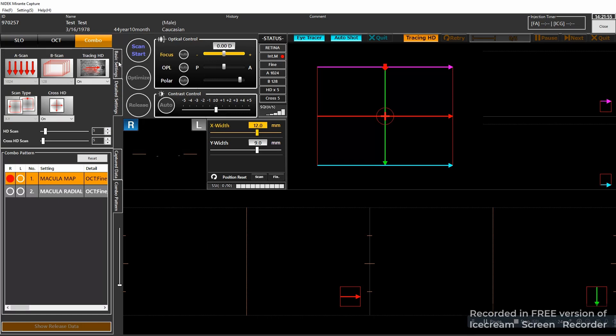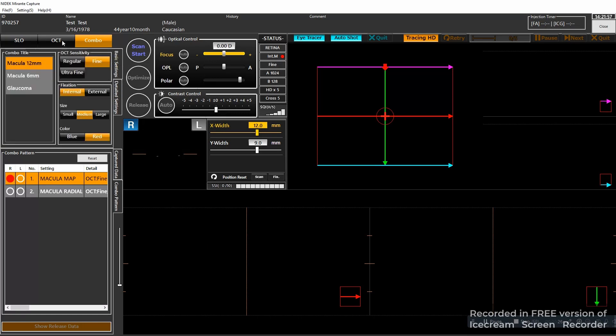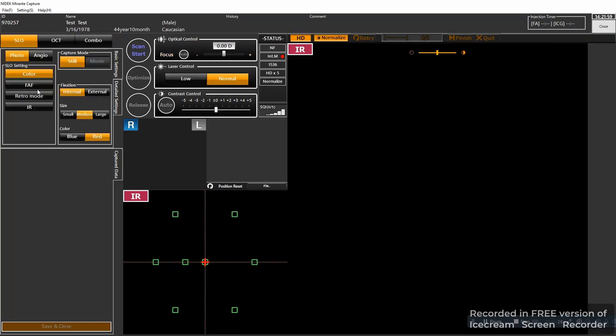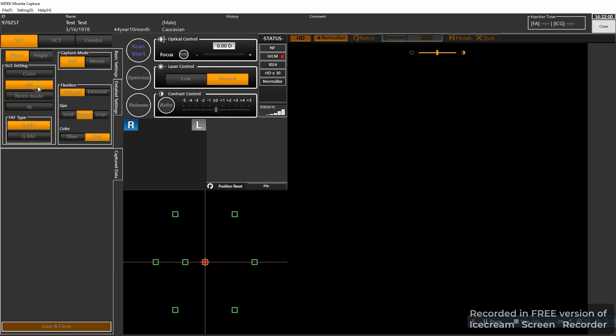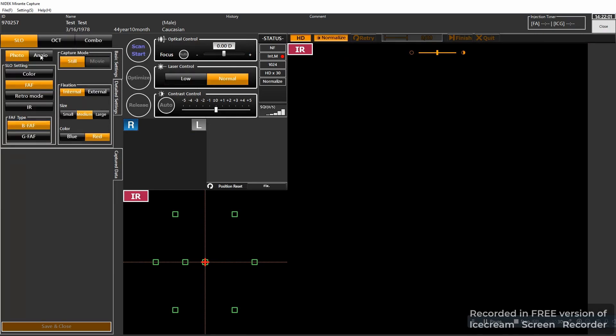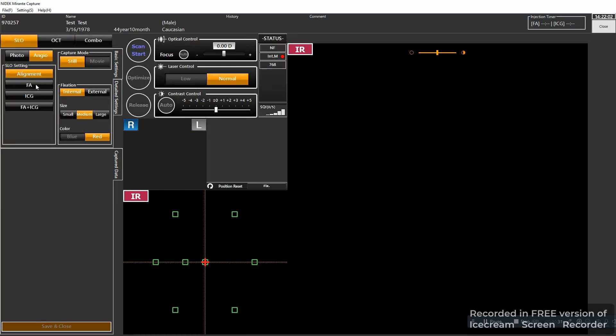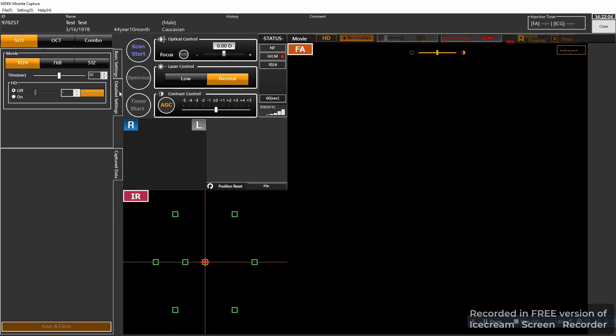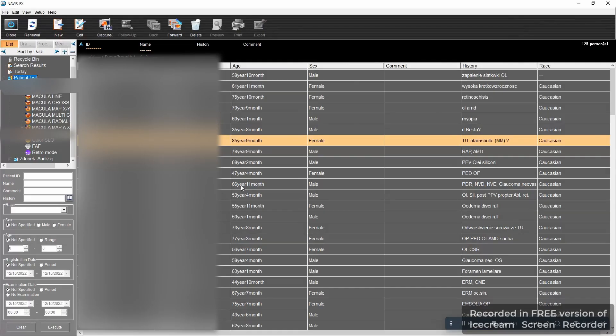If you click combo, combo is like protocol so you have protocols for glaucoma or macula that you wish for. Back to the SLO you have the angio, FA, ICG, and here again you can change the resolution or you can change the number of frames for a movie.